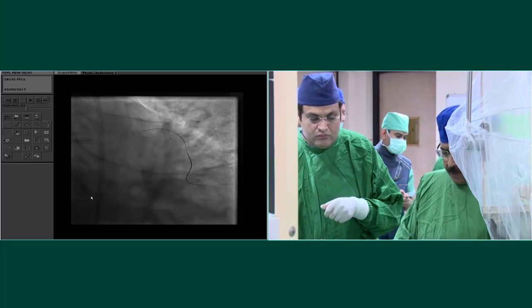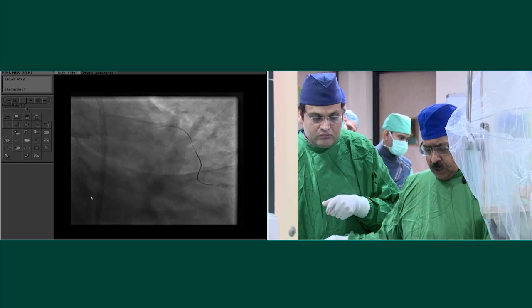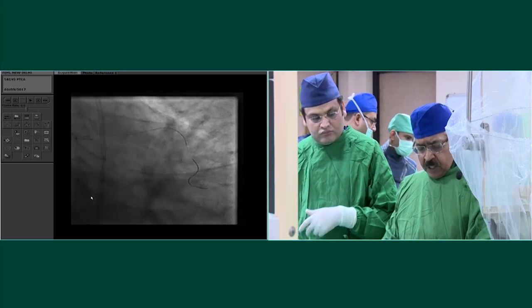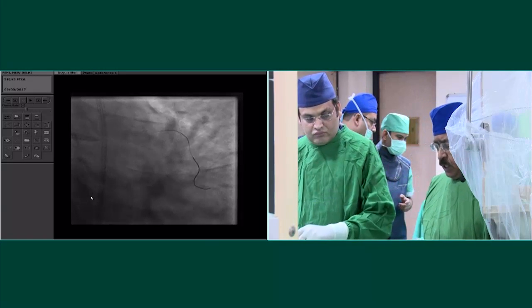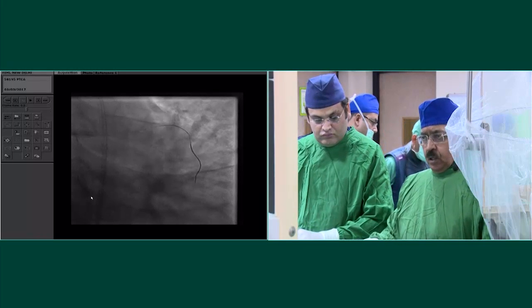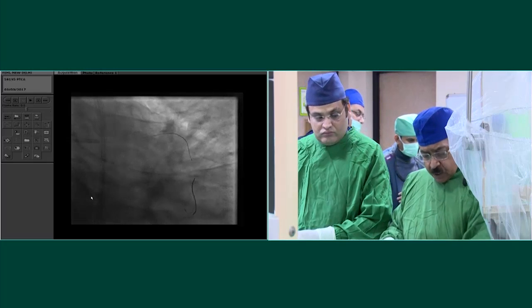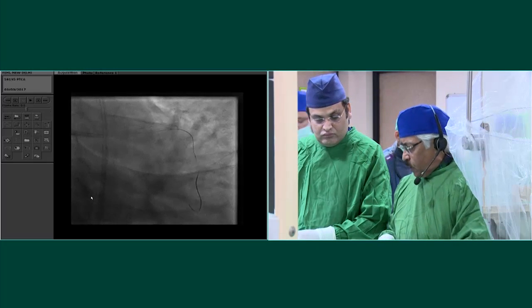Okay, so my balloon's done, and there was not much indentation. We don't want to split this vessel indiscriminately, and so I'm actually happy now to go down and look at it and see what happens. Are we working on the BMW? That's correct.